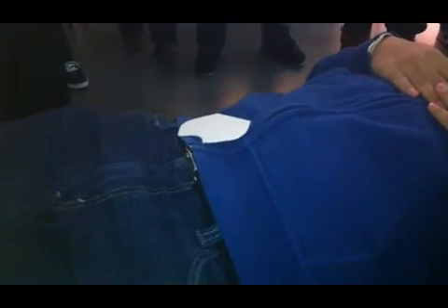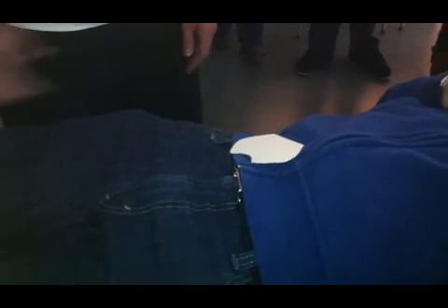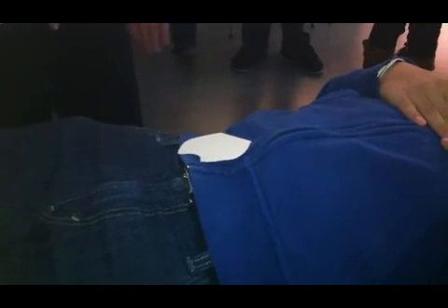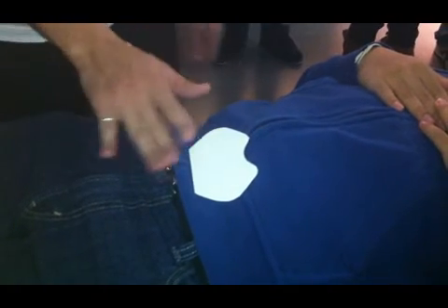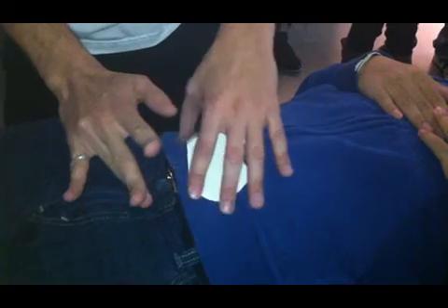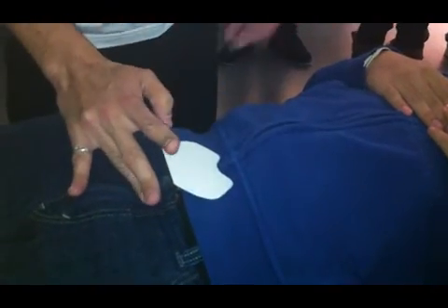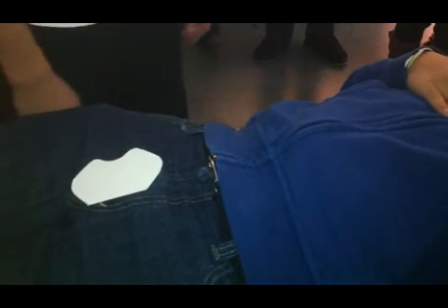Hold your breath, don't breathe. Make sure you use your arms here. This is not an actual patient, this is just a student. So find the symphysis, because I'm going to go in there and find the symphysis, and if your shield is above that, with a little pressure on your bladder, just above that, then I'll know it's in the right place. For the guy, just below that, then I'll know that's in the correct place too.